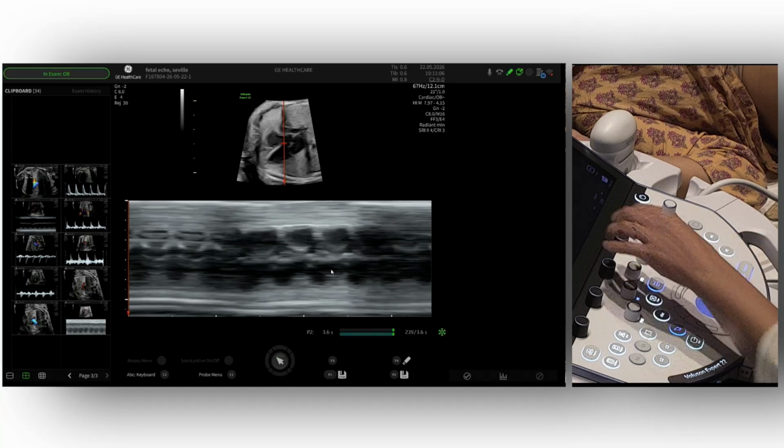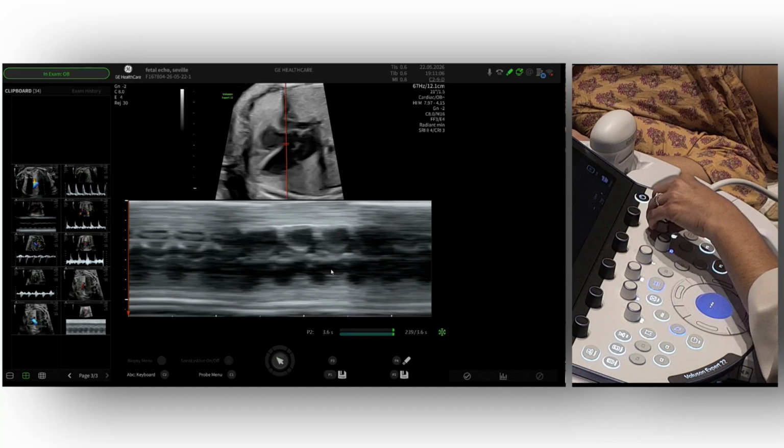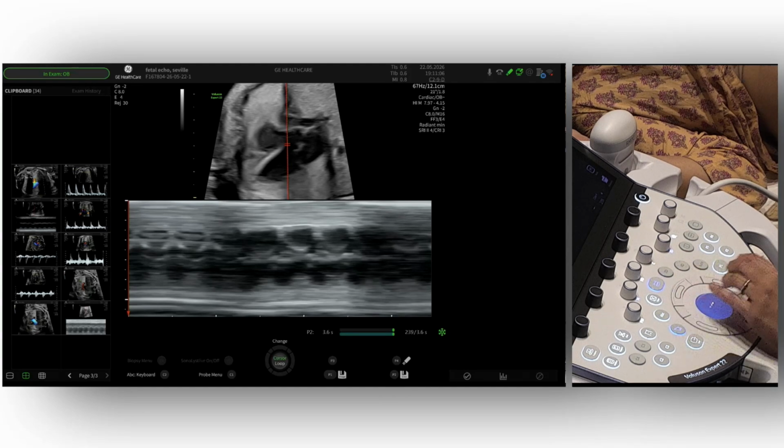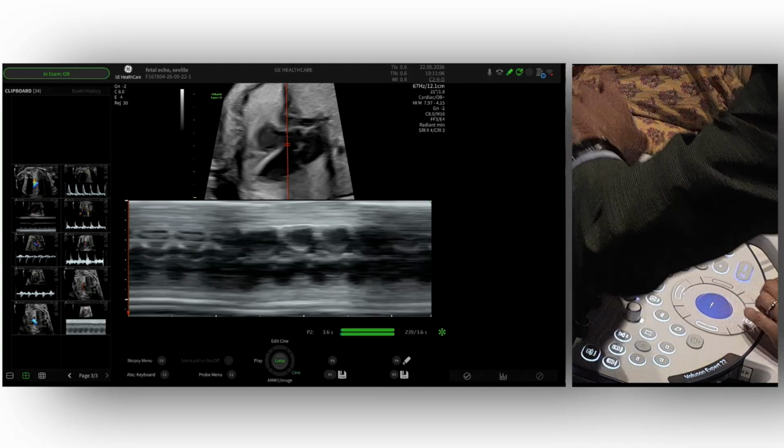Okay, that's not great, but let's start with it, and then we can try to get it better. If we look up here, can we move the image up? No, no. To move the image up.